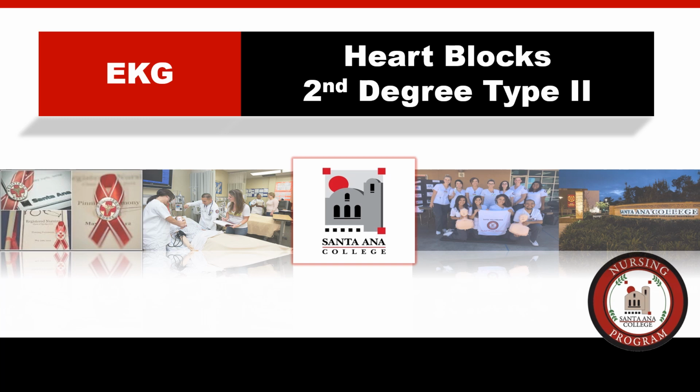All right, guys, that wraps up our heart block for this semester. We have gone over first degree heart block, second degree heart block type 1 or Wenckebach, and second degree heart block type 2 or Mobitz 2. When you get into next semester, you'll learn about third degree heart block, which will complete all of the heart blocks. But for now, we're just looking at first, second degree type 1, and second degree type 2.